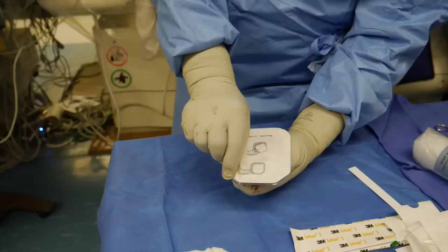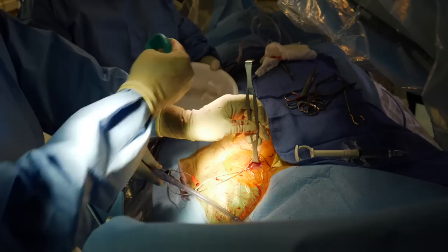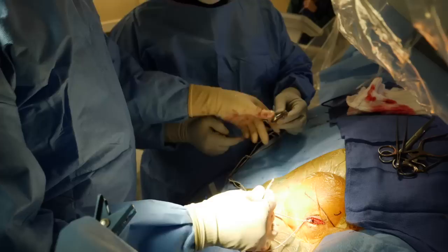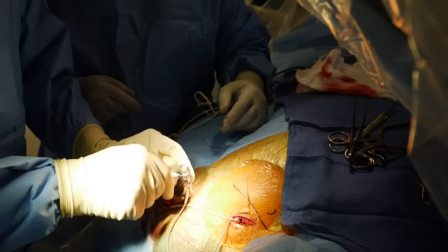Here we are opening the pacemaker — it's a sterile device. We take off the outer cover; there is the pacemaker unit, which is the battery and the computer. The leads are going to plug directly into that header. We flush out the tissue pocket we created with a sterile flush, making sure everything is clean with good hemostasis and no additional bleeding. We implant the leads into the header of the pacemaker and use a set screw to secure those leads so they can't come out.